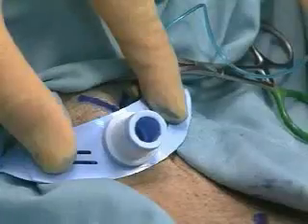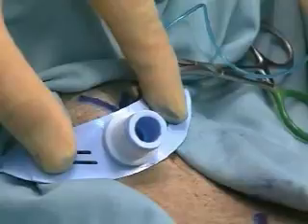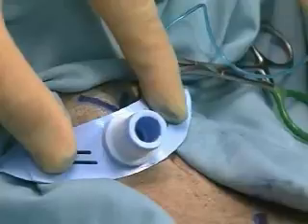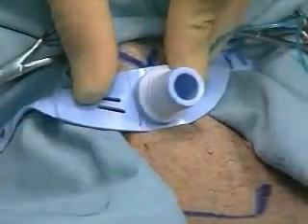Attach an ambu bag and ventilate the patient with 100% oxygen. Auscultate the chest to confirm equal and clear breath sounds bilaterally. Control superficial bleeding either with direct pressure or with hemostats and silk ligatures if necessary. Suture the tracheostomy tube to the skin with 2-0 Prolene suture.